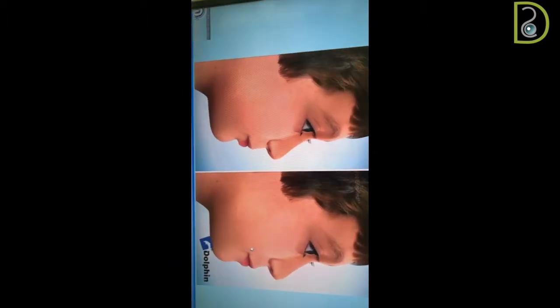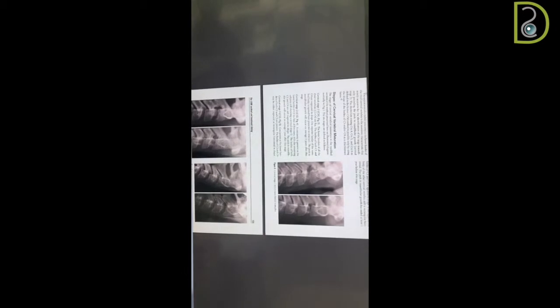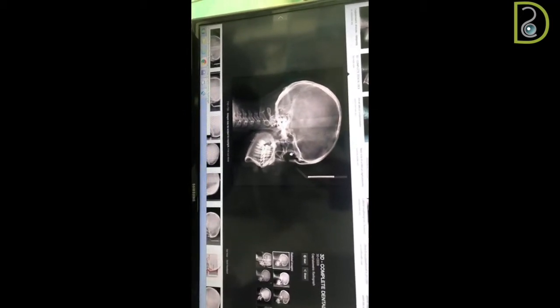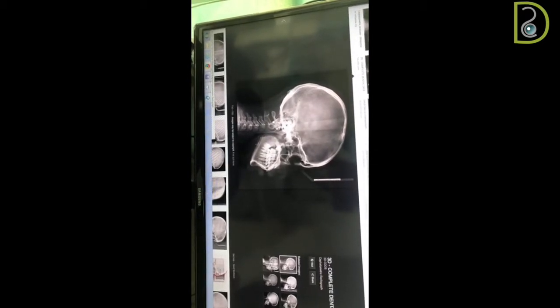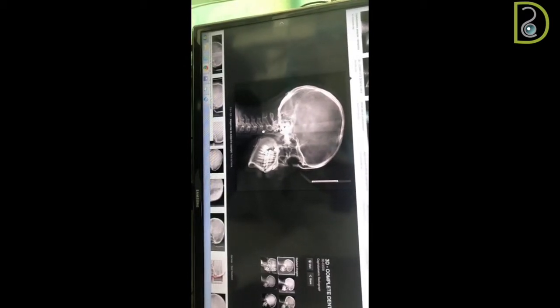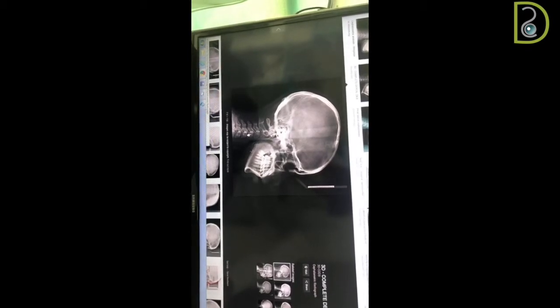And how do we know this? In the past, we used to take hand and wrist radiographs to evaluate, but nowadays we have a different way of doing it. Every patient comes to us, we take a lateral cephalometric radiograph. So instead of exposing the patient to a hand and wrist radiograph, as I take a lateral cephalometric radiograph, I evaluate the vertebrae bones of the patient. We look at the cervical vertebrae number 2, number 3, and number 4. As you can see, they are there in the radiograph, so I don't need to expose the patient again.